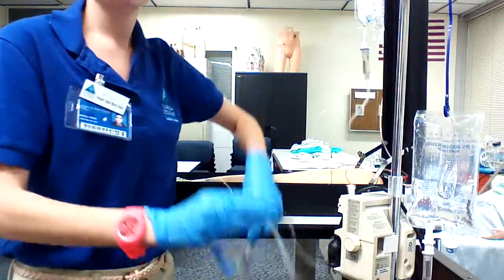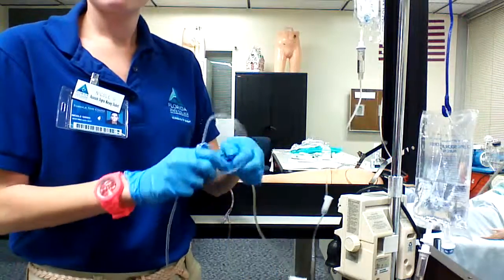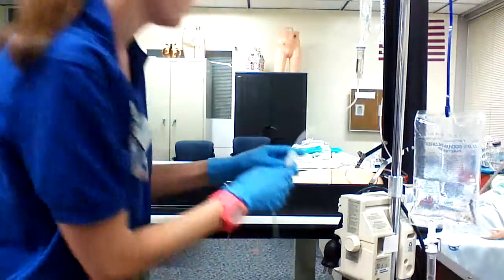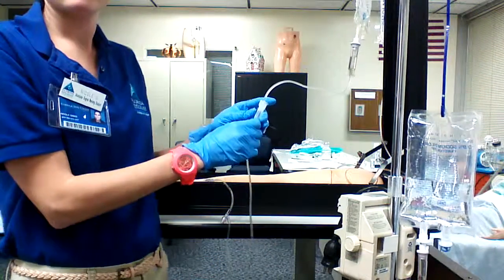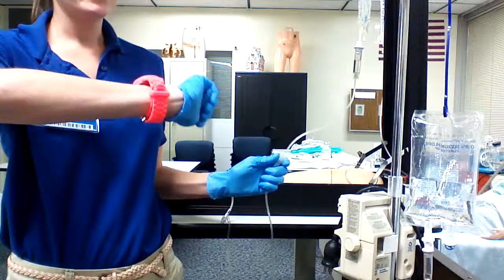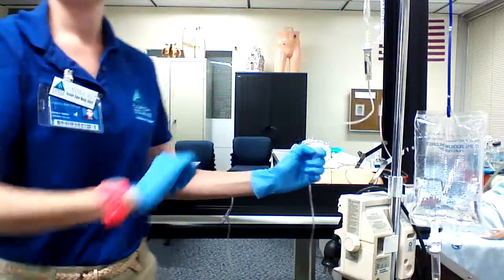Okay, I'm going to clamp my primary tubing, and I'm going to unclamp my piggyback and set the flow rate, which is 14 drops per minute. So I'm going to set that and make sure it's right, and it is.